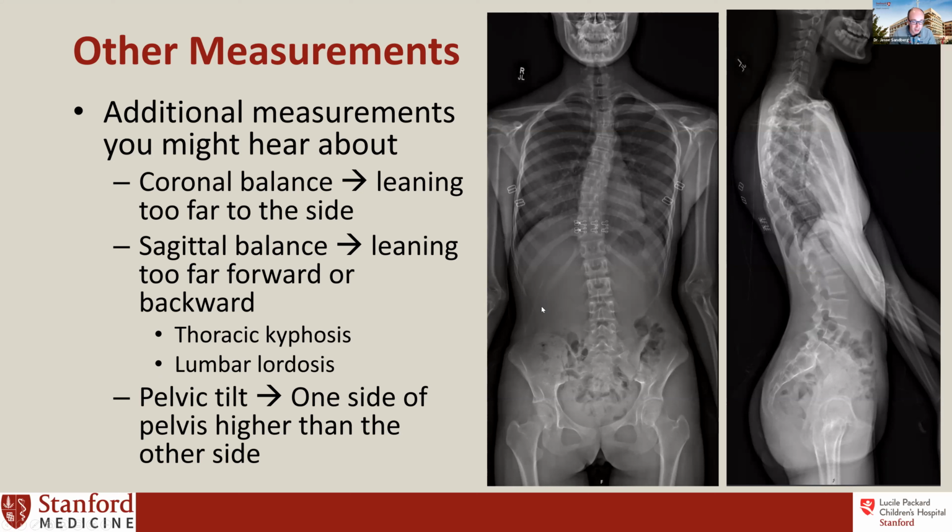I'm also assessing, as I mentioned before, something called pelvic tilt. Sometimes a scoliosis will cause the pelvis not to lie horizontal in comparison to the earth, and I will measure that as well. This can also cause lower extremity issues. And so that's why we're looking at all these different things. It's kind of a cascading effect. When you have certain issues with your angles, it could cascade down to the pelvis and then the lower extremities, and obviously cause pain for your kiddos.